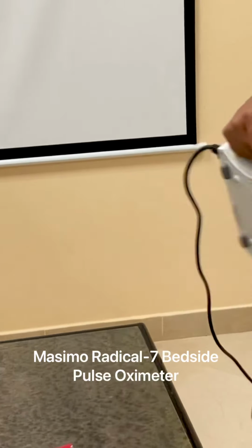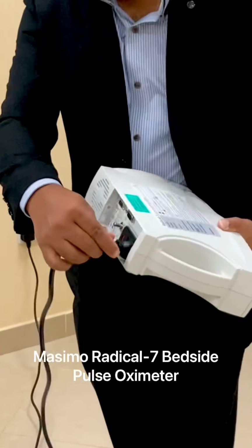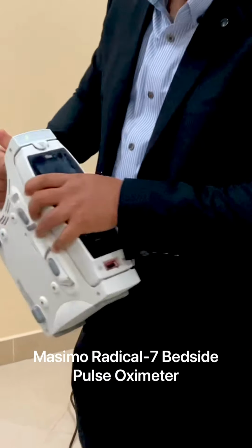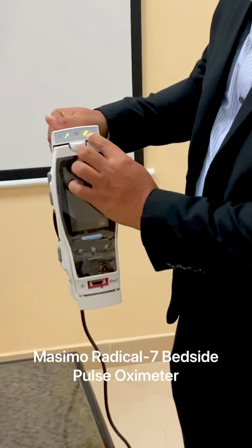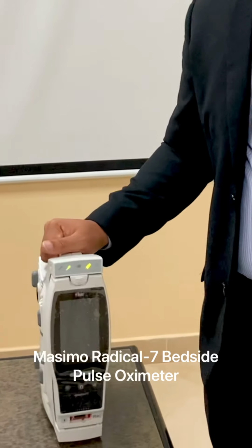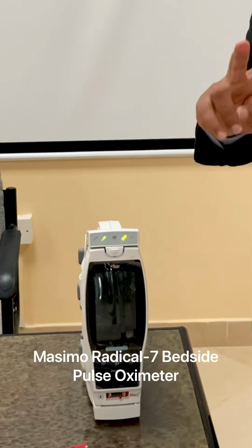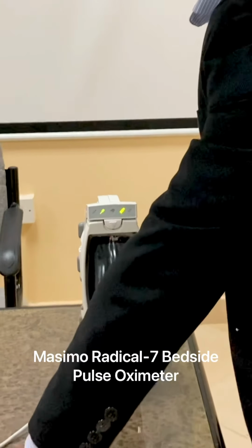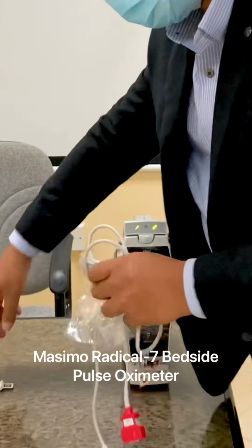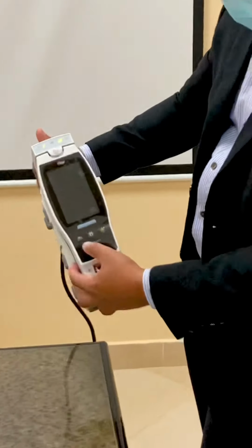Next, you can connect the power from here to the power cord, so that the charging mode will be active. You can see the charging and the battery charging here. I already talked about two components, and the last two are the patient cable and the sensor. The sensor is disposable and it's available in the store, I guess.